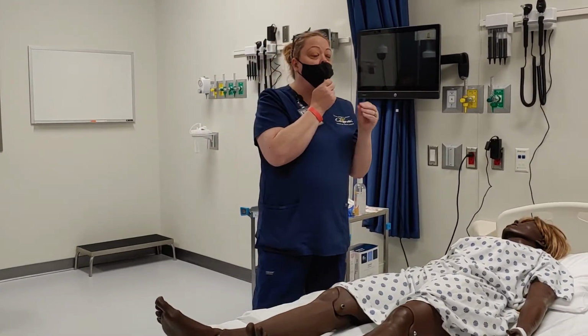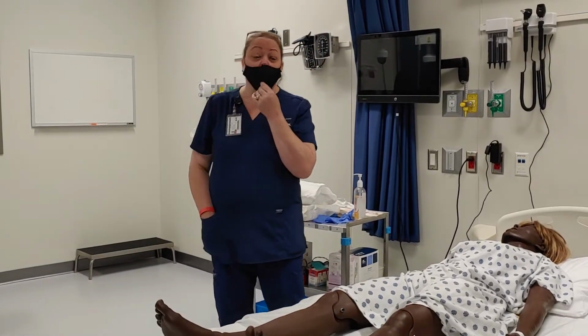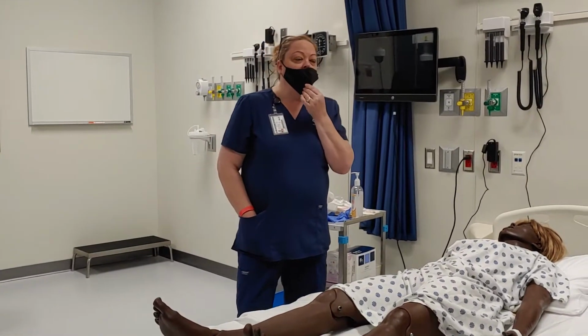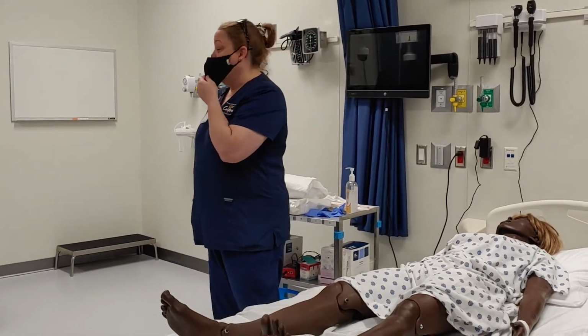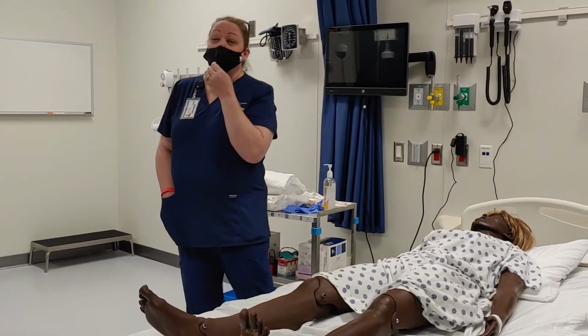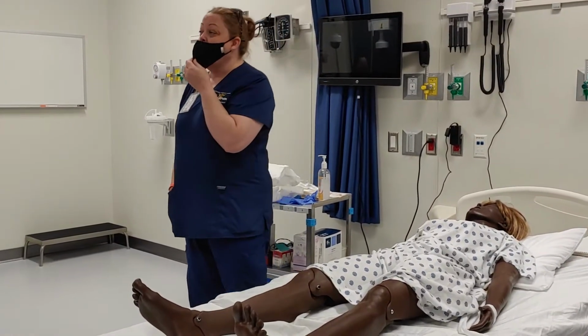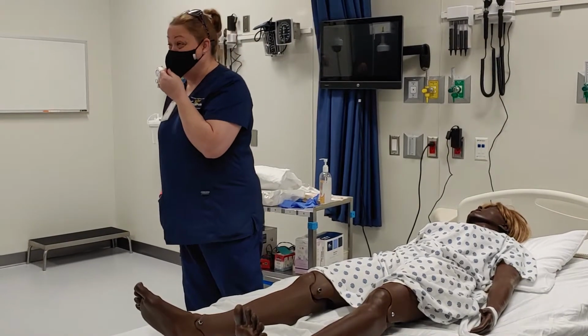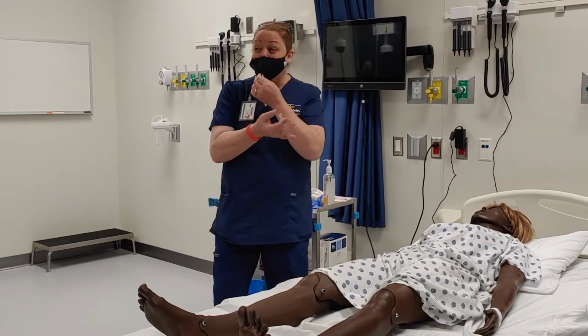It's just in there. It could be for a couple purposes. Perhaps somebody's having difficulty draining their bladder. It could be that they've just had some type of bladder surgery. So for whatever reason, they're needing help draining their bladder, or it can also be that we need a sterile specimen. So sterile meaning it's coming directly from the bladder.